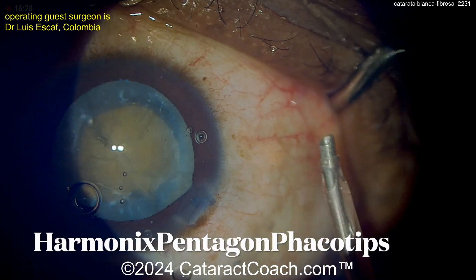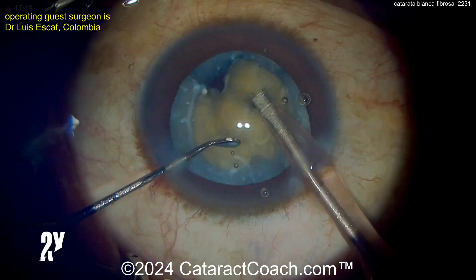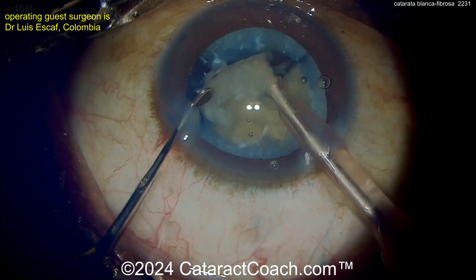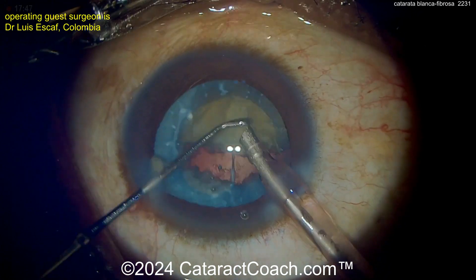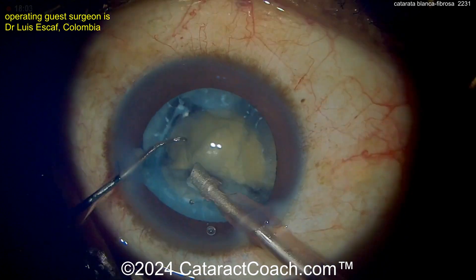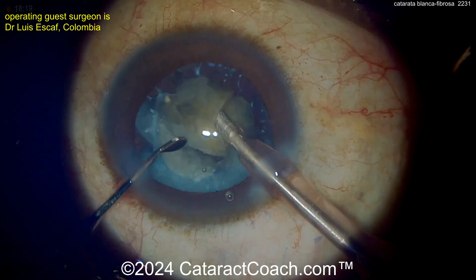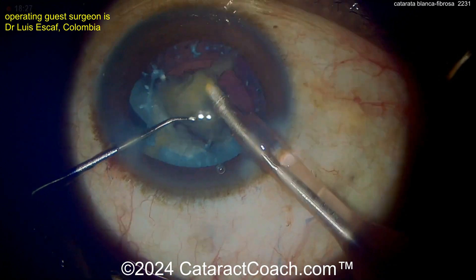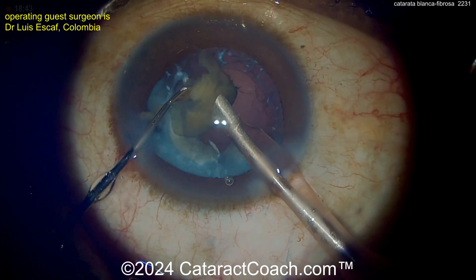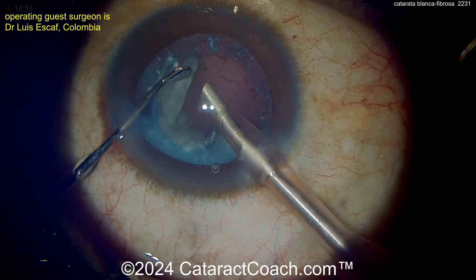Now switching over to the phaco tip — here's his phaco tip he's going to put in the eye. This is the hollow bore tip used to emulsify the pieces, and these come out pretty easily. Again, look at that capsule — there are areas where you have fibrotic lens material stuck to the undersurface of the capsule. You may not get all of these out. This is the nature of these advanced cataracts when patients present with very dense, opaque cataracts that have been there for a long time.